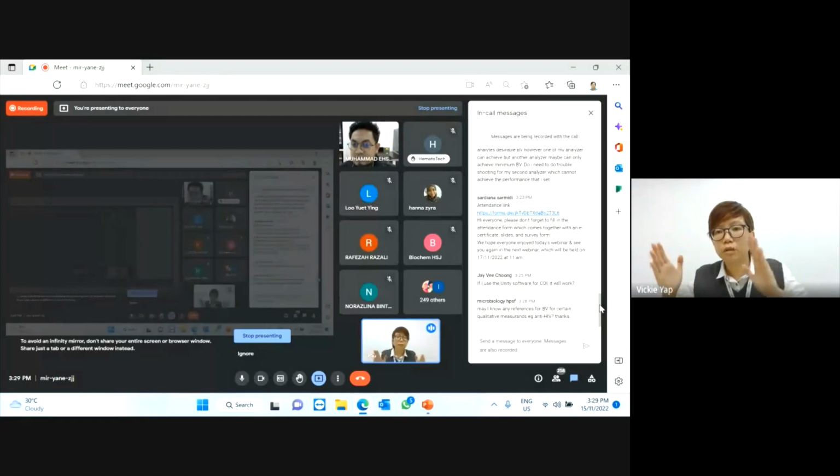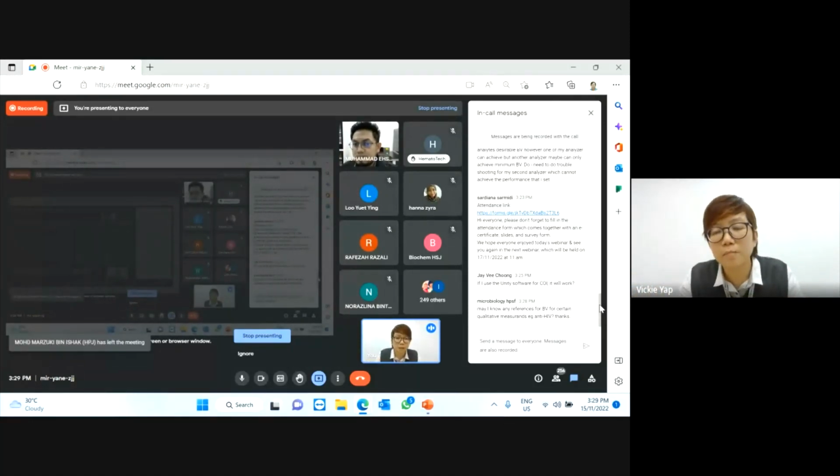So you need to troubleshoot the minimum machine to make sure both are comparable, or you reduce both requirements. We always refer to the lowest or the worst requirement. Either you drop your requirement so that the two machines are on par, choosing the minimum requirement, or if you insist on desirable performance, then you need to troubleshoot the minimum BV machine up to the desirable standard.